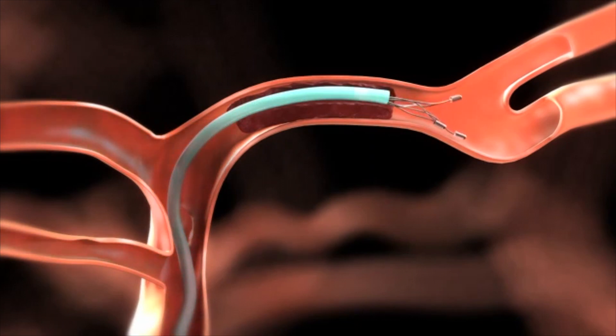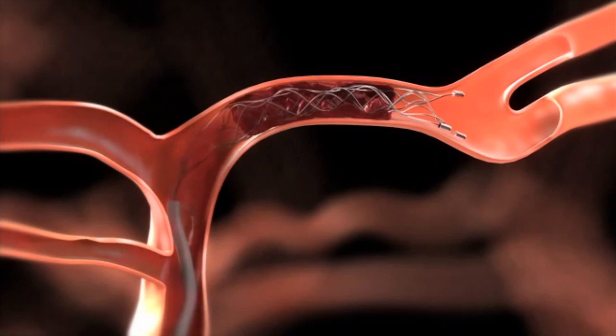The usable length of the deployed solitaire FR should extend past each side of the thrombus. Tighten the RHV around the micro catheter and angiographically assess the revascularization status of the treated vessel.